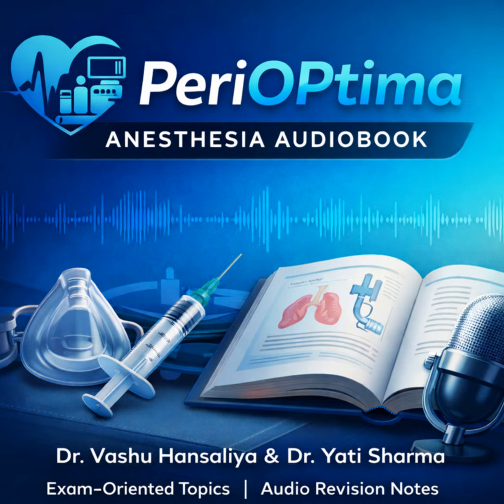Let's discuss the one-way valves. The inspiratory and expiratory one-way valves in the circle system are just fundamental safety components. And their role is to enforce unidirectional flow of gas through the circuit and through the CO2 absorber. And that prevents rebreathing of CO2. It does. If a valve sticks open or it leaks or it's just incompetent, rebreathing occurs. That leads to hypercapnia and respiratory acidosis, which can significantly destabilize a patient under anesthesia.